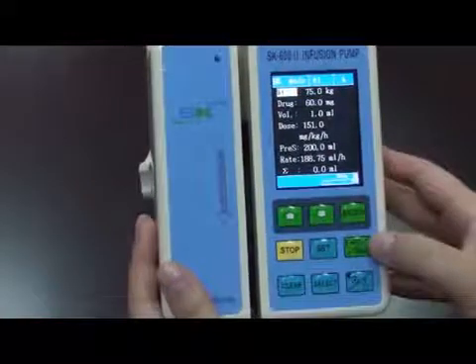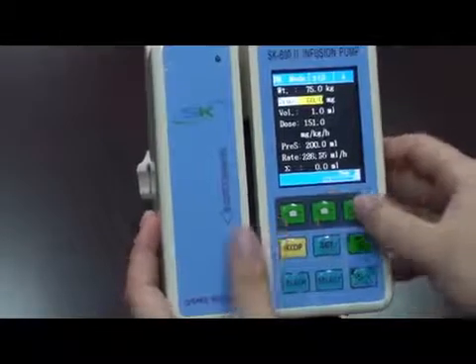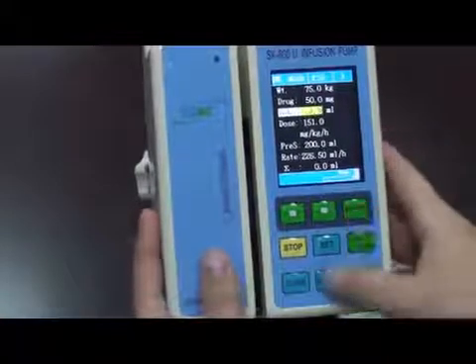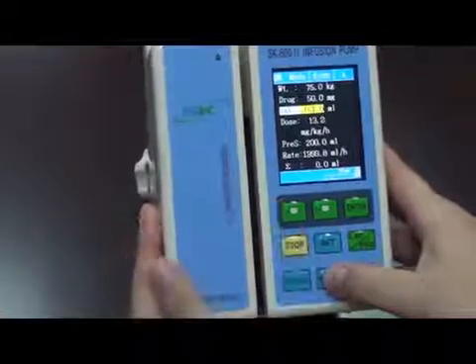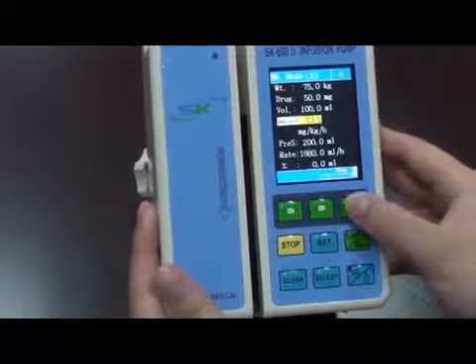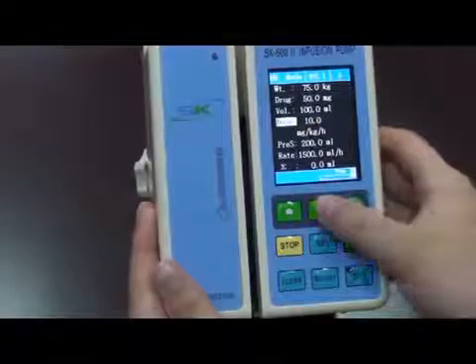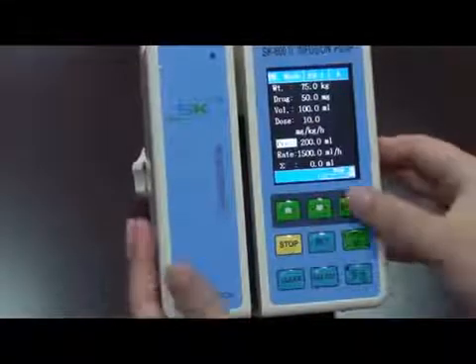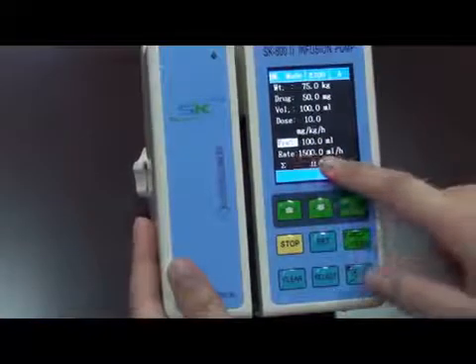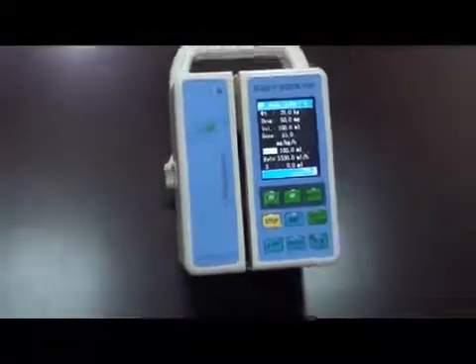The drug amount is 50. Then choose the volume — it's 100ml. Next, set the dose, maybe 10. Preset volume is 100. You can see the rate here is quite large, but the rate is calculated automatically after you set all those parameters. This is body weight mode.